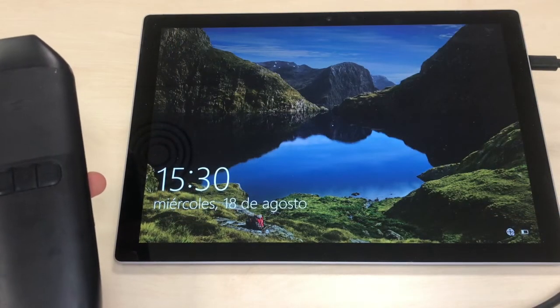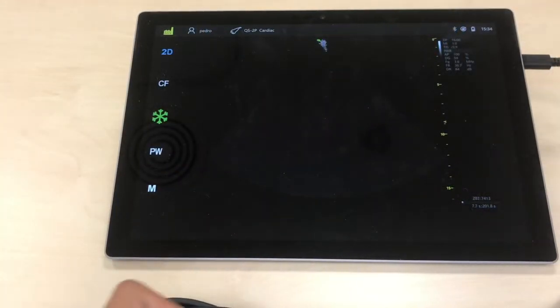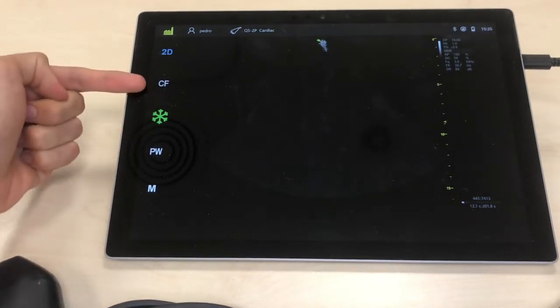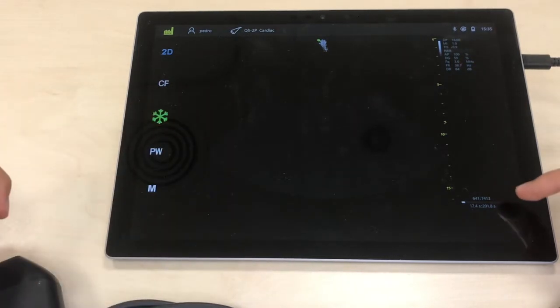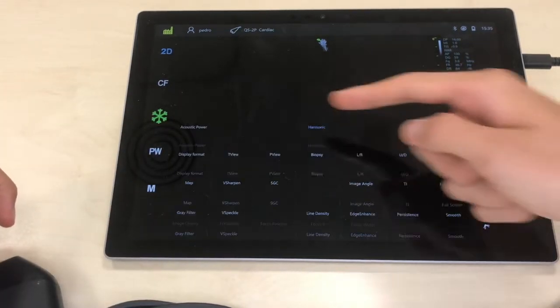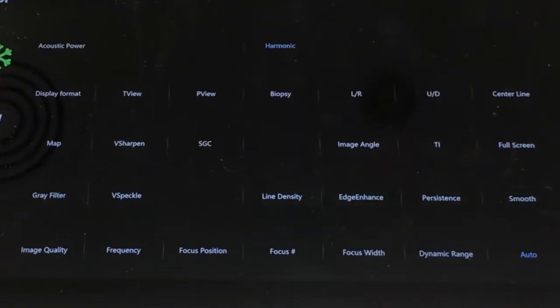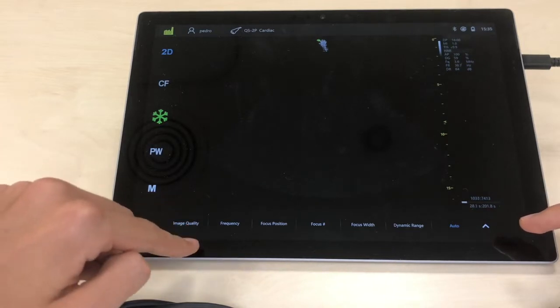The boot-up time is usually less than 30 seconds. This is the main page of their app and we can see it has quite a lot of features. On the left we can choose the imaging mode between B-mode, color Doppler, pulse wave Doppler, and M-mode. On the bottom bar we can find some advanced imaging settings typical of advanced machines and not of pocket devices. This device is the most similar to cart machines I have reviewed so far with regards to imaging settings.